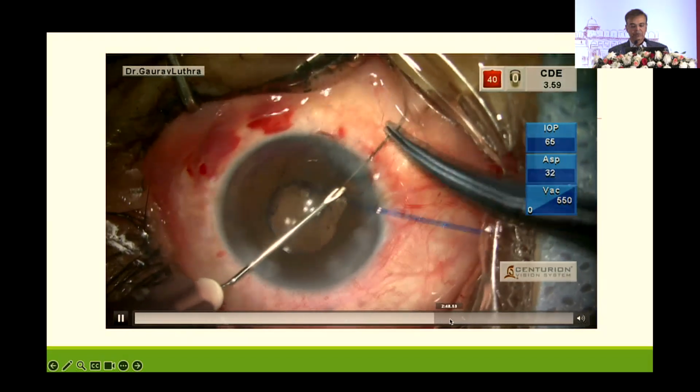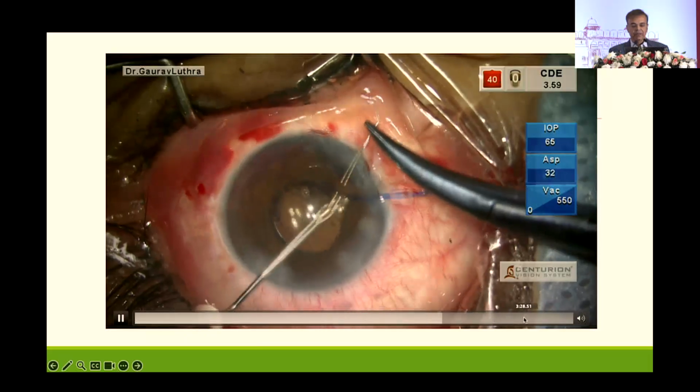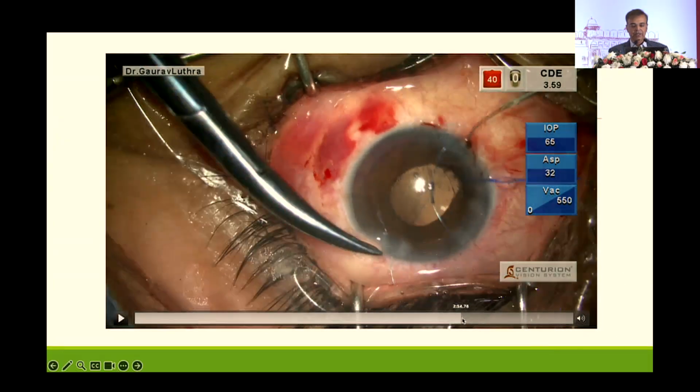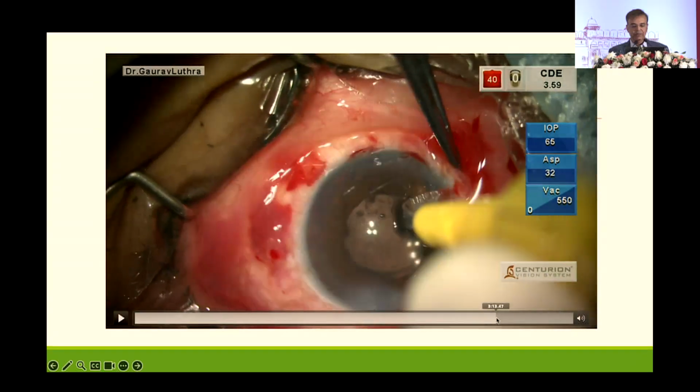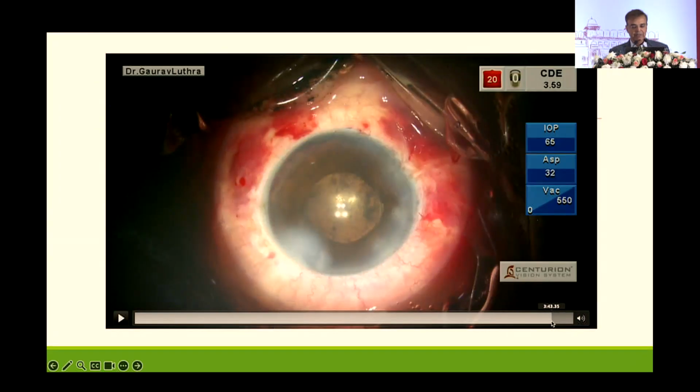So 3 sutures passed, and you can see that now I'm ensuring that the iris is not pulled at all, and capturing it into that 26 gauge needle which is ready to receive the suture. So eventually 3 Hoffman pockets do a great job there. And of course there are many ways to deal with this, but this worked well for me. Patient did well over here.